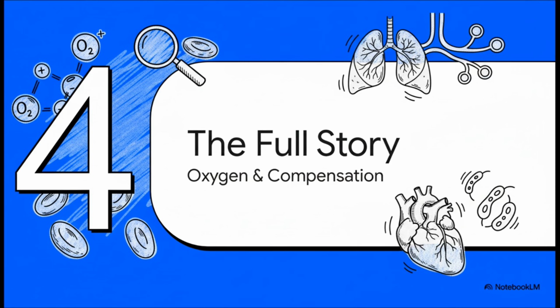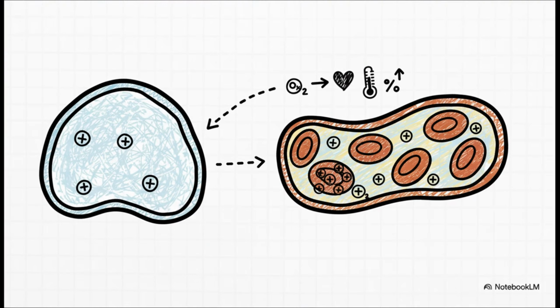A good detective never stops there, right? We need the full story. And that means checking on oxygen levels and seeing if the body is trying to fight back. This part of the file, this is all about the patient's immediate safety. How well is oxygen getting from the lungs into the blood?